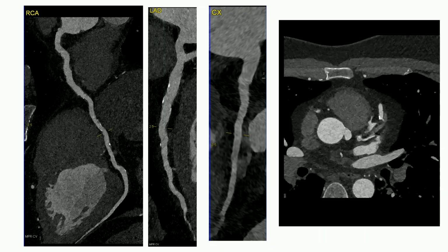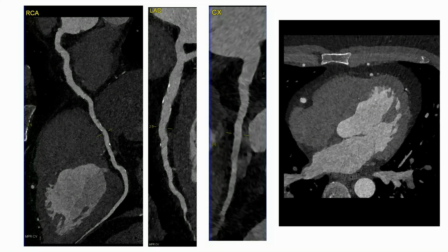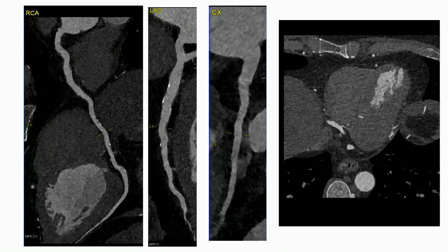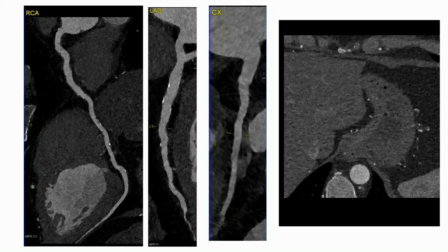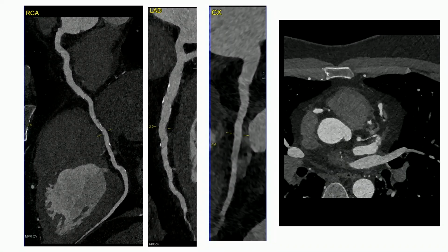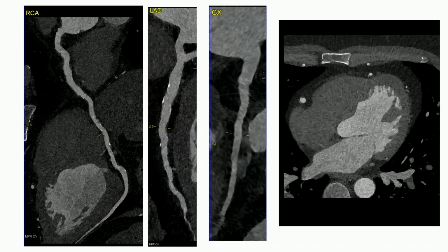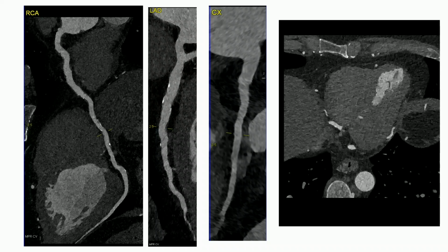So he undergoes a coronary CTA. This is using a photon counting dual source CT. On the left, you can see the curved MPRs, just to show you the RCA, LAD, and circumflex. And I think you can see maybe some speckles of white stuff, some calcified plaque, but overall, certainly no obstructive disease. This is what we would call a CAD-RADS 1, so minimal stenosis.